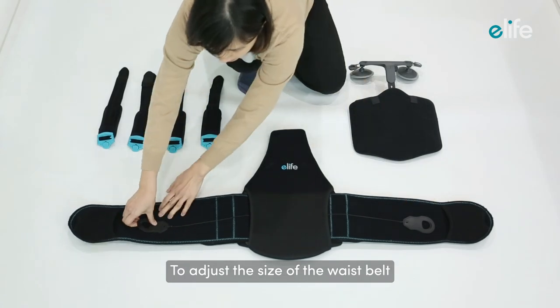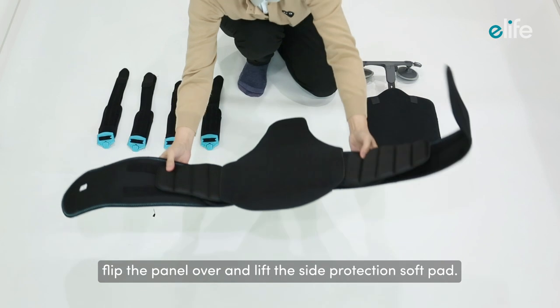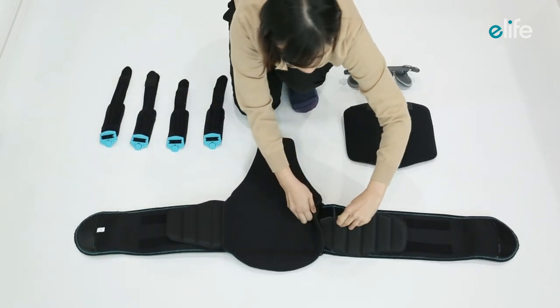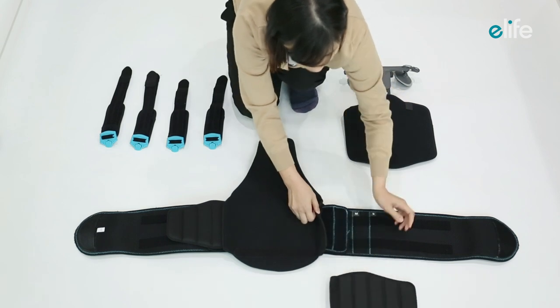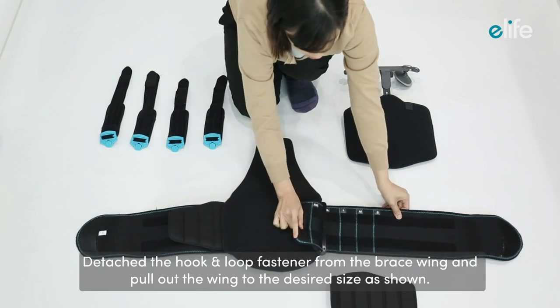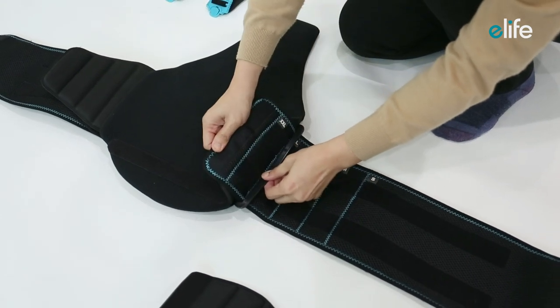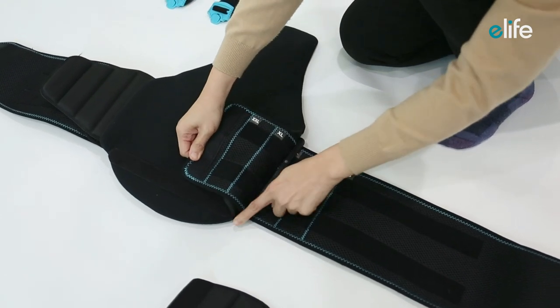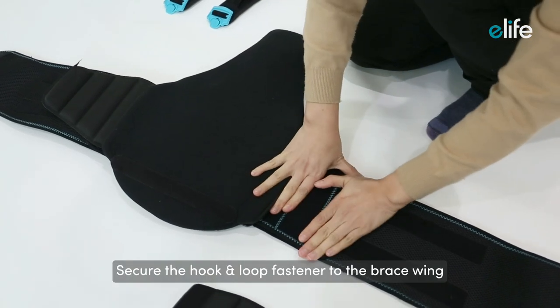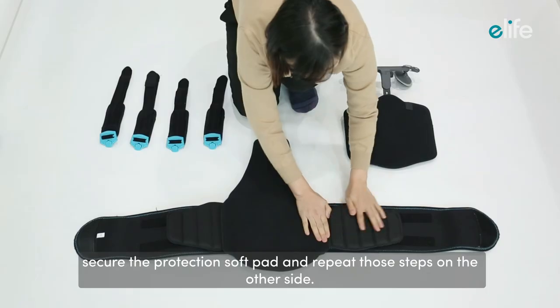To adjust the size of the waist belt, first lift the compression pull tab, flip the panel over, and lift the side protection soft pad. Detach the hook and loop fastener from the brace wing and pull out the wing to the desired size. Secure the hook and loop fastener to the brace wing, then secure the protection soft pad.